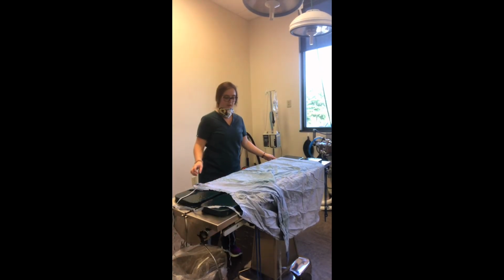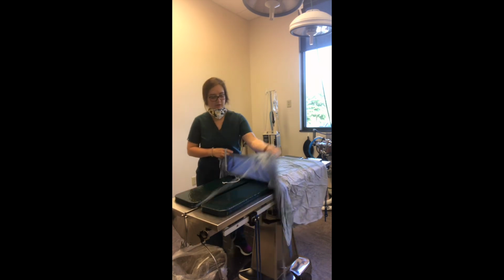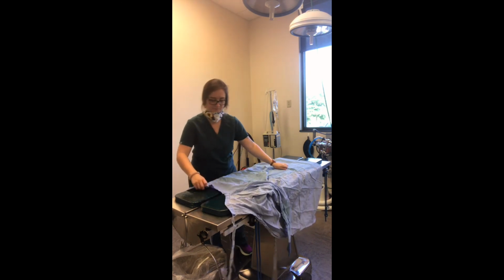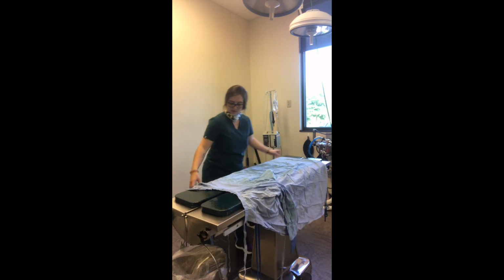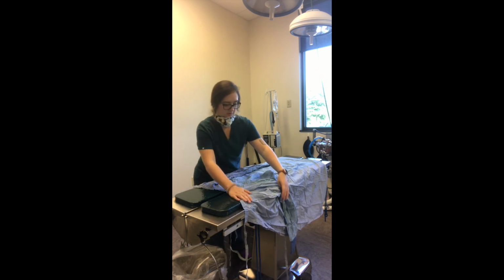Now I'm going to demonstrate how to fold a gown for a gown pack. We have the inside of the drape face down on a table. You're going to take the arms, fold them towards the middle.